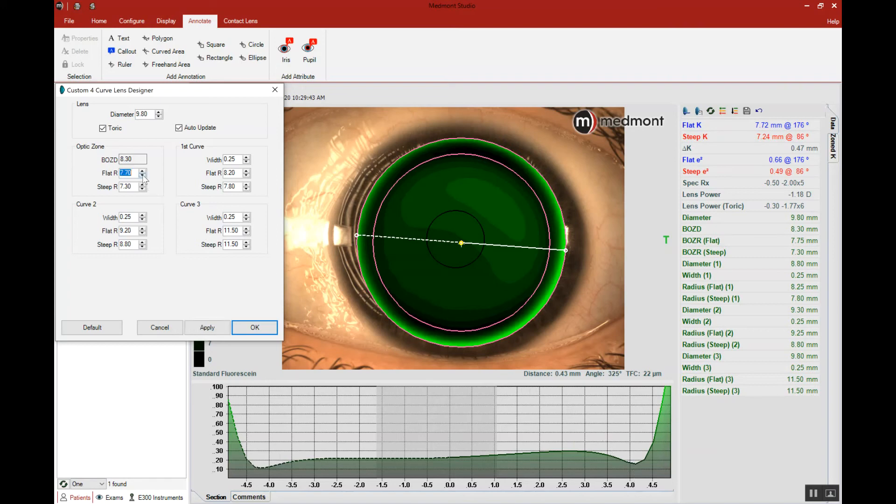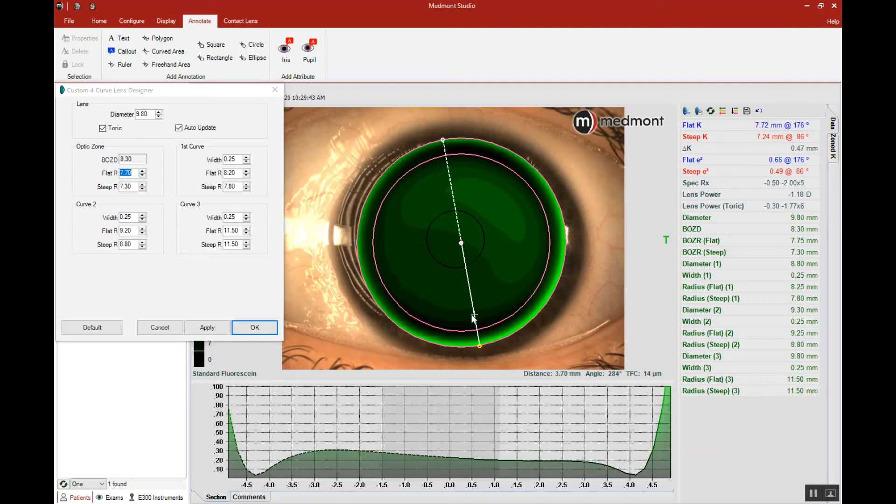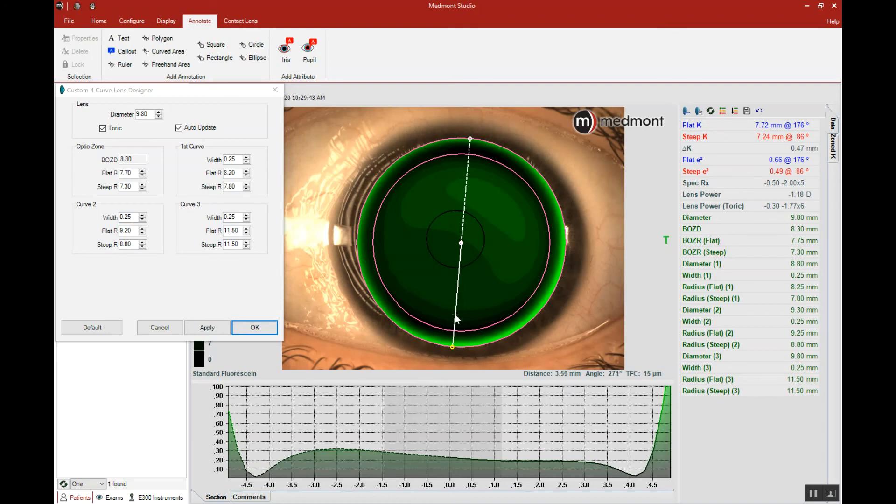So let's steepen the base curve at least one step.